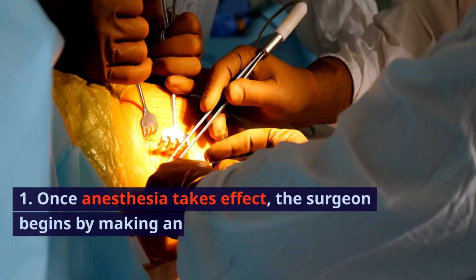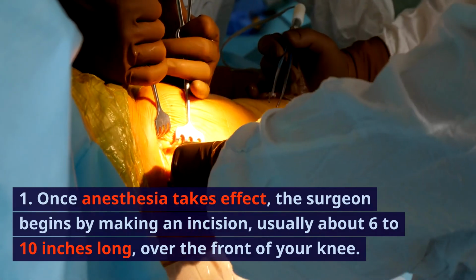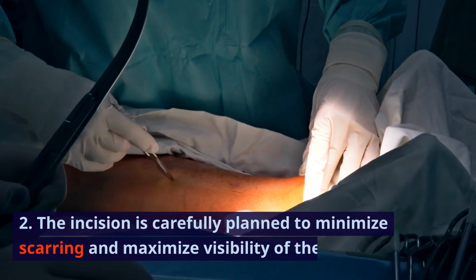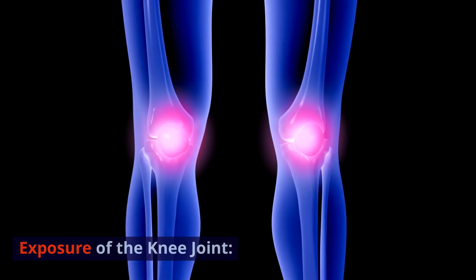Once anesthesia takes effect, the surgeon begins by making an incision, usually about 6 to 10 inches long, over the front of your knee. The incision is carefully planned to minimize scarring and maximize visibility of the joint. Exposure of the knee joint.